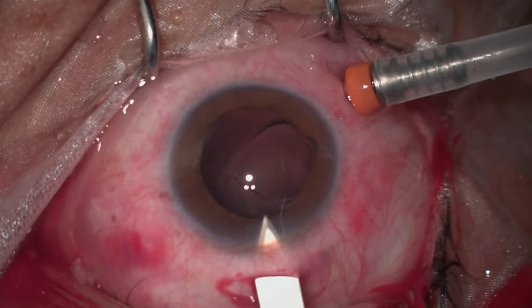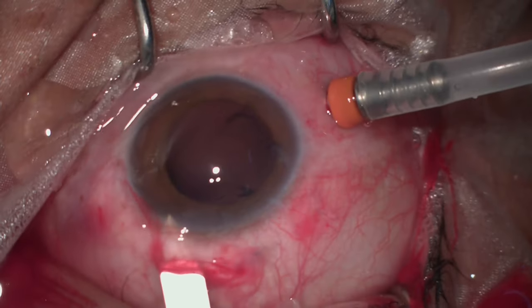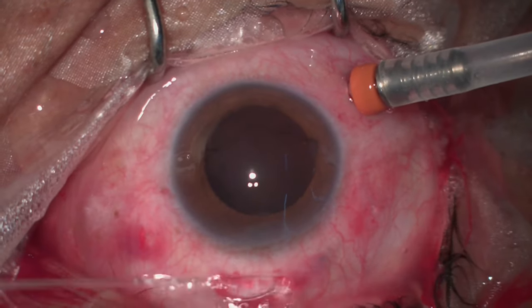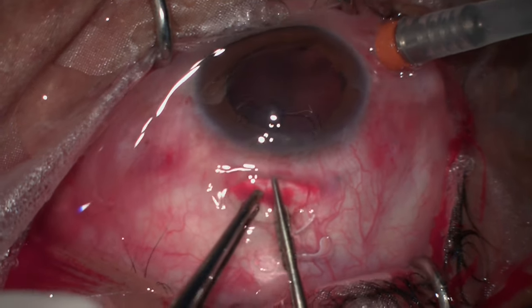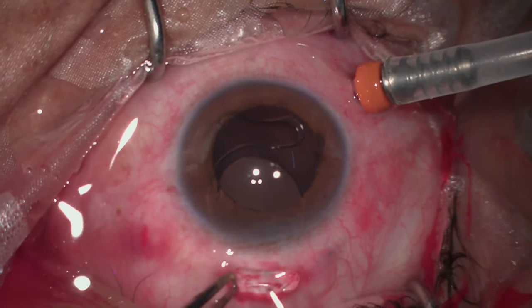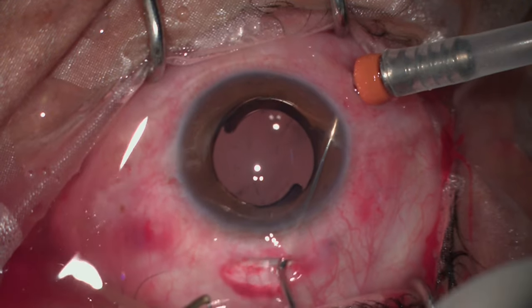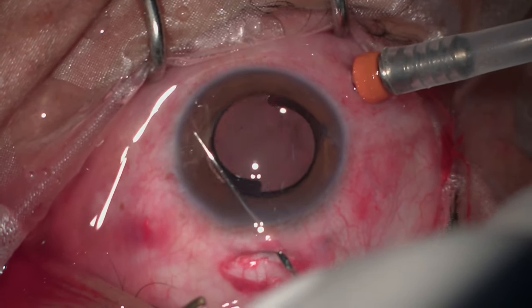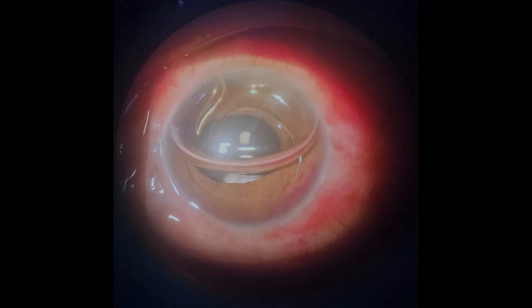My IOL choice here is the Kelman anterior chamber design. These lenses are very easy to insert, remain stable, and don't cause further trauma to the eye. Compared to other designs, they are less time-consuming, straightforward, and maintain excellent centration.